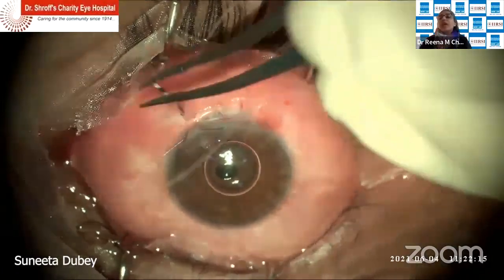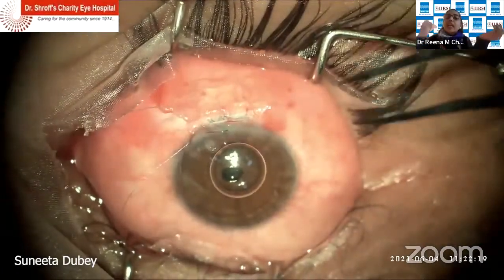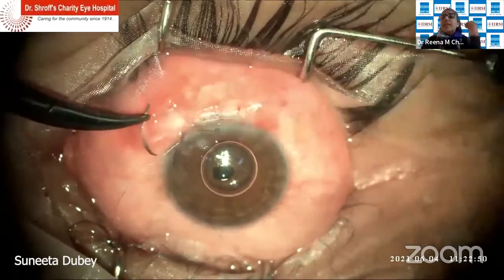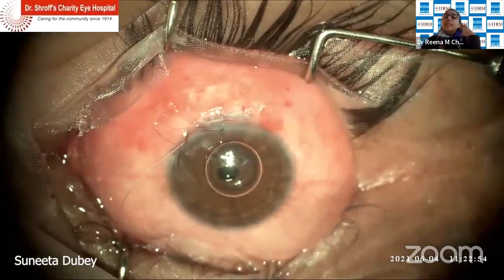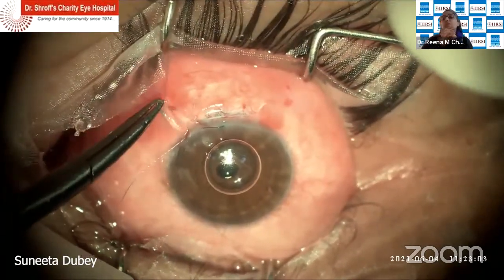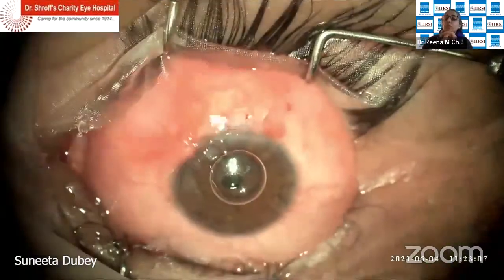And if it's not an ooze, I adjust my sutures. I either tighten my releasable or loosen it a little bit to make sure that I get an end point where I have an ooze and the eye is neither too soft nor too hard. But I don't want a dry wound or a very, very over-filtering wound.